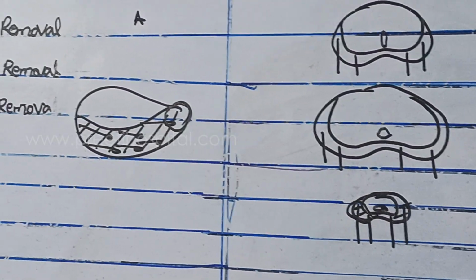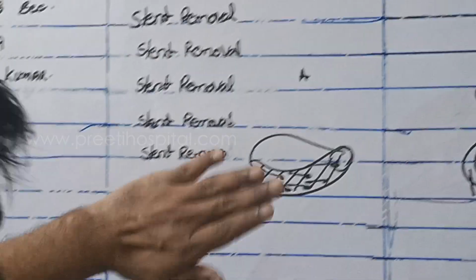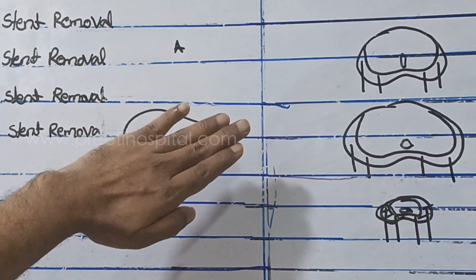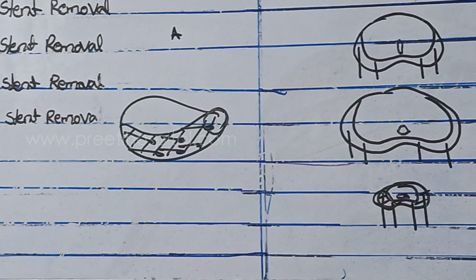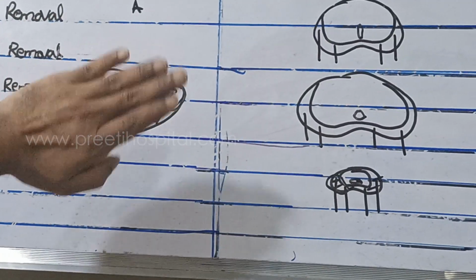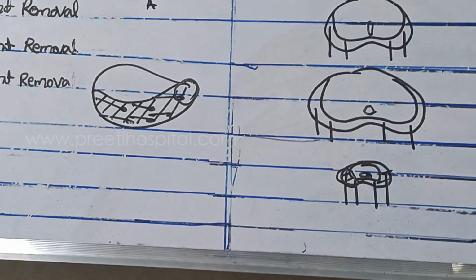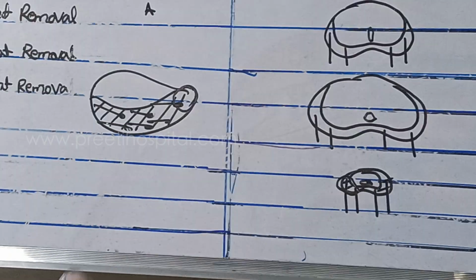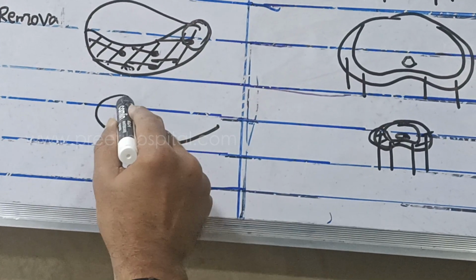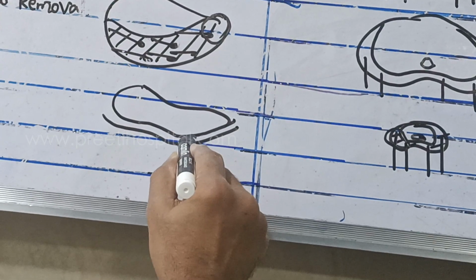Okay, but when you see from the top, this is on the side. You are seeing from the side, one side lateral. Or when you see from the bottom, top or bottom are different. Side is different. This is side. You can't see the urethra here. When you see from the top or bottom, how will it be? The way we have shown.